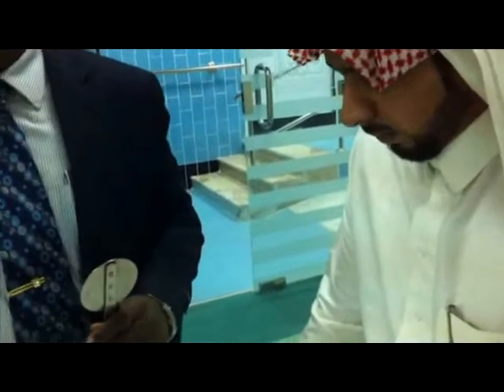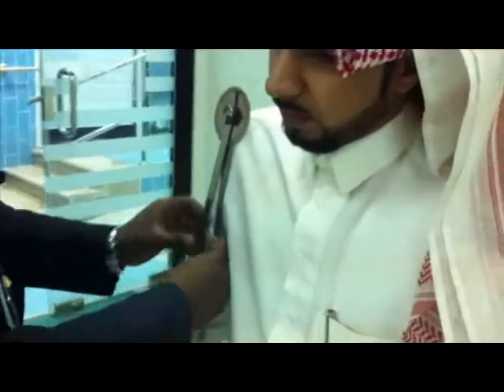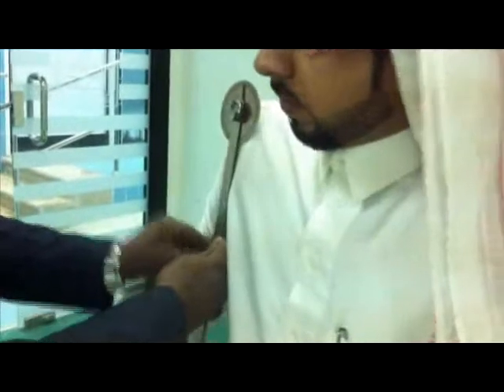Acromion process. Patient position: sitting. Therapist position: in front of the patient. Fulcrum: acromion process. Mobile arm to the humerus. The stable arm is parallel to the body, beside the body, parallel to the trunk.